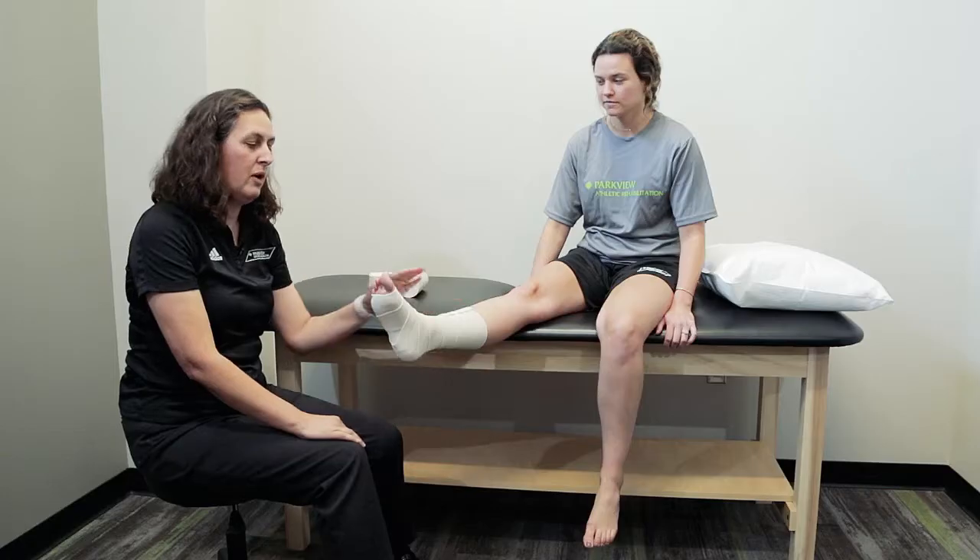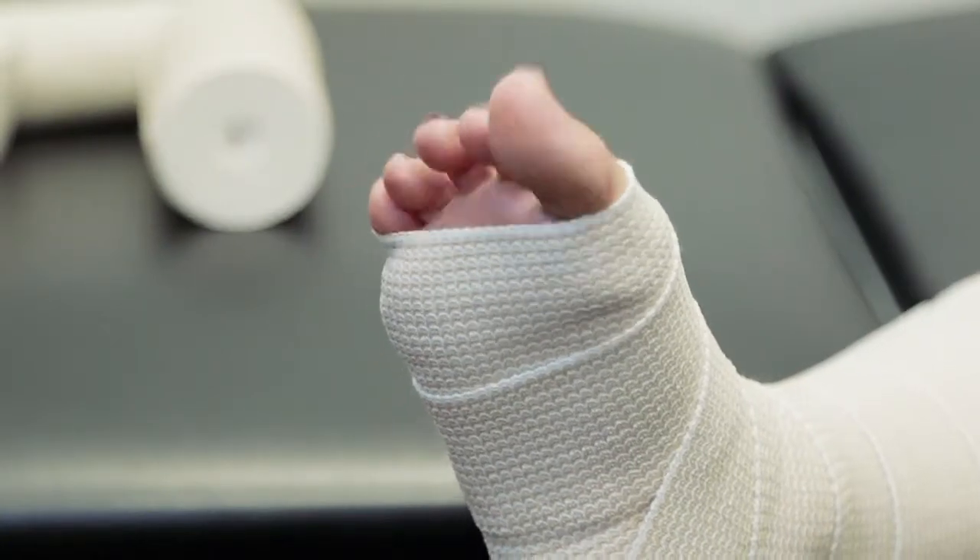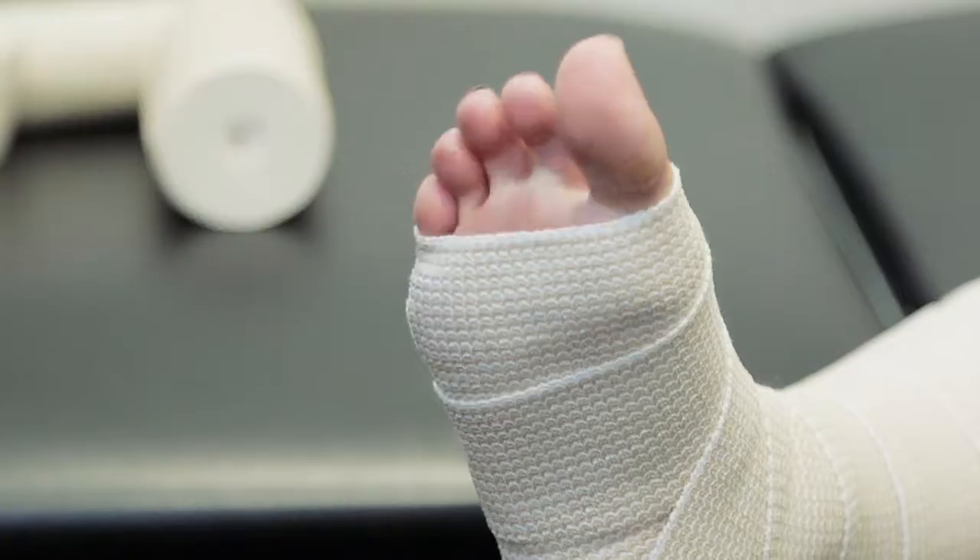Once you complete the wrap, you'll want the patient to wiggle their toes to make sure the compression wrap is not too tight. If the toes begin to turn blue or white, your compression wrap is too tight.